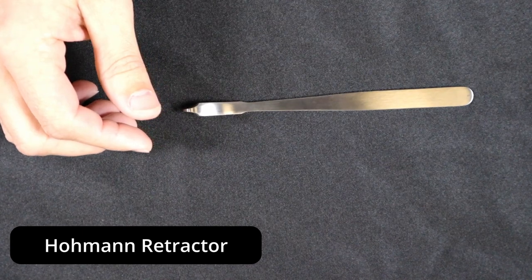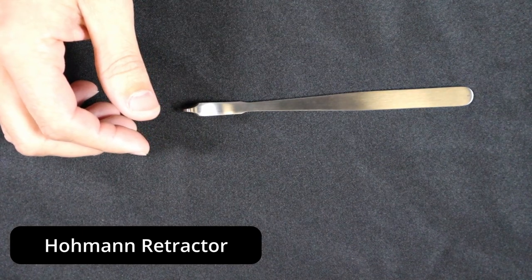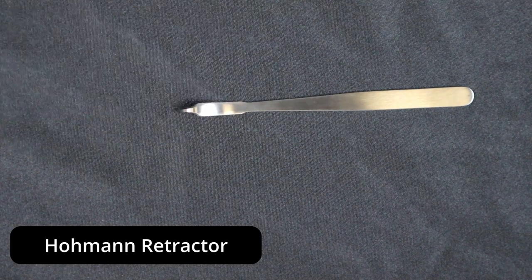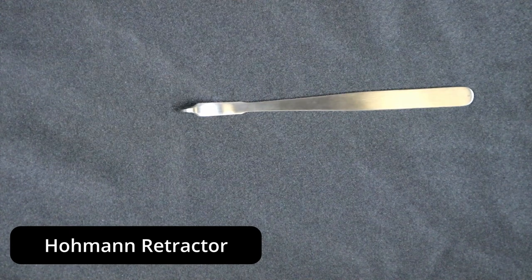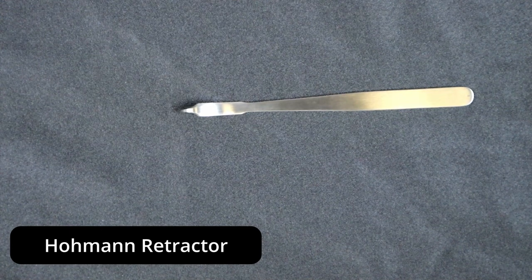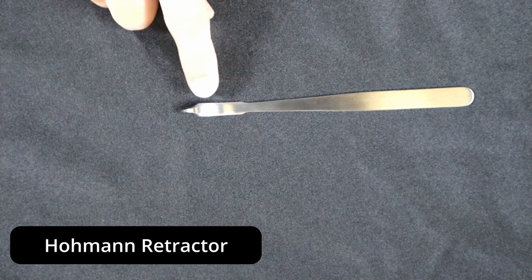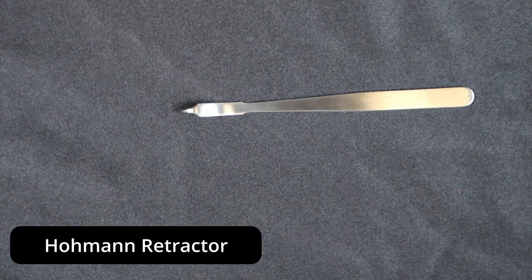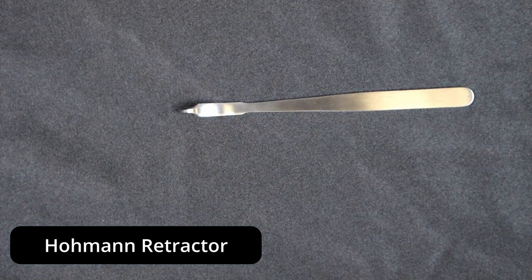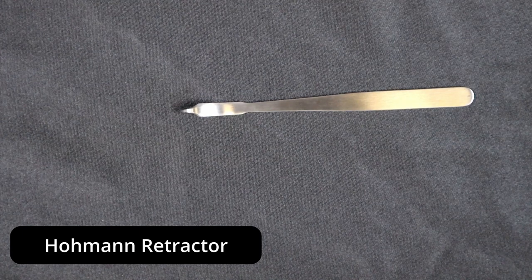You'll often see these in your orthopedic trays, and this instrument is used for exposing bone during procedure. You've got a broad flat blade with a curved profile that makes insertion and exposure easier for the surgeon.